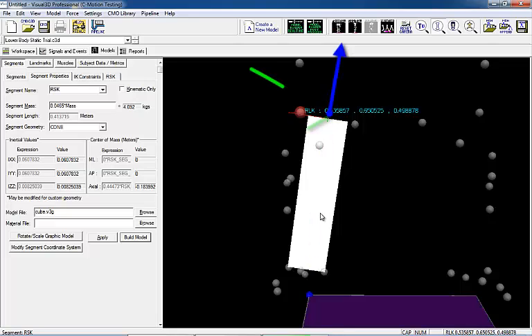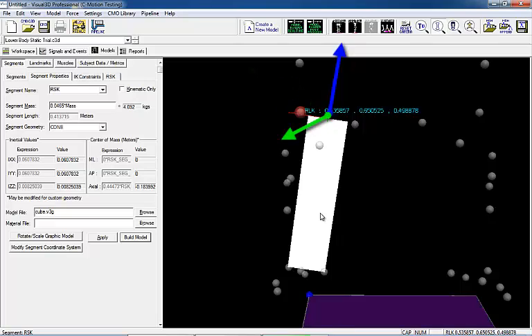Then, the y-axis, indicated by the green, will be defined perpendicular to the z-axis and frontal plane. Finally, the x-axis, indicated by the red axis, will be defined by the z- and y-axis using the right-hand rule and will lie along the line of the plane.